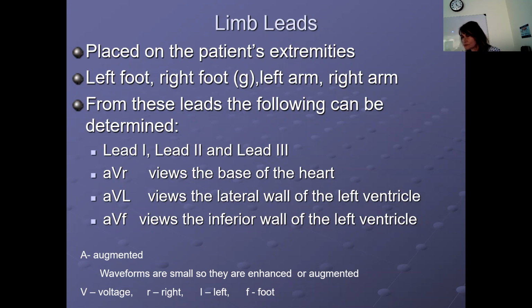No. And it shows the thigh? Yeah, it showed the thigh. Wow. Oh, interesting. And now there's 18 lead and 20 lead EKGs also.